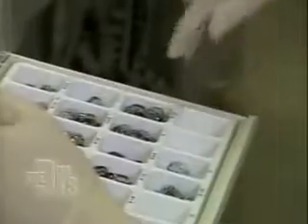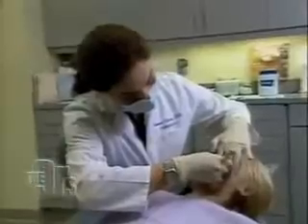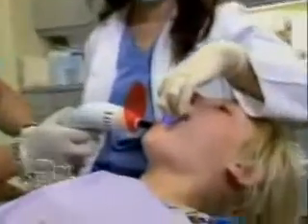Let's roll. I'm gonna fit the bands. Okay, bite down for me. There you go. Open. One more bite. Perfect. One more time. Good job. So now I'm gonna try it in his mouth. See if it's fitting. Open up. We're using a light cure cement. The light makes the cement hard. You can't take it out, so it's all nice and fixed. I think we've got it. Yep. I'm talking a little weird, but overall, it's not hurting.